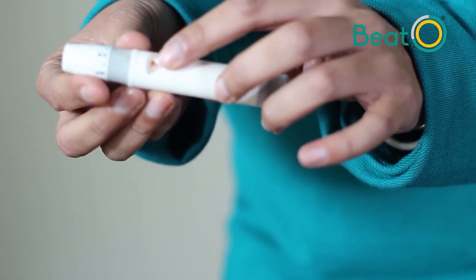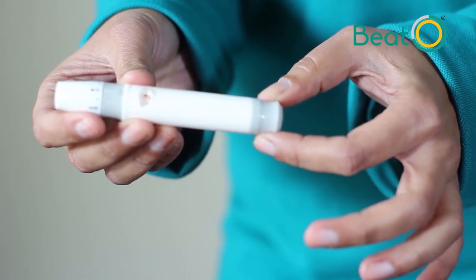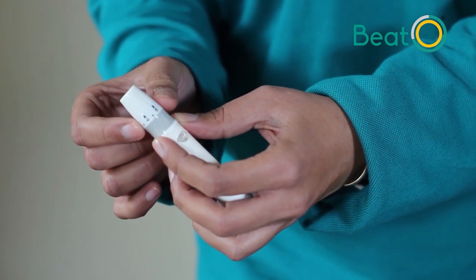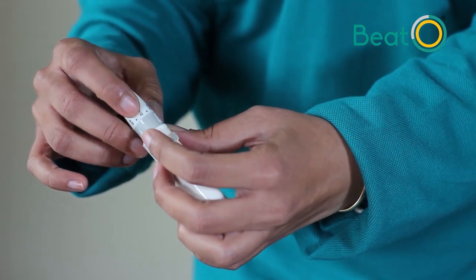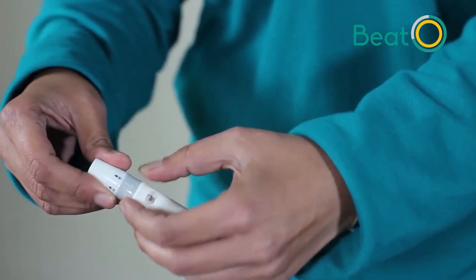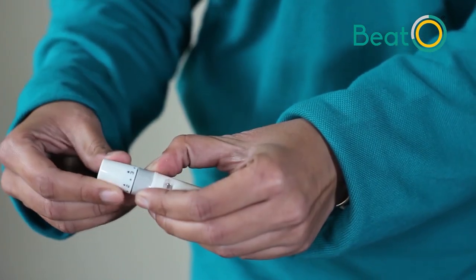Your trigger button should turn red. If it hasn't, pull the sliding barrel to make it turn red. These are the puncture depth settings, which will change depending on your skin type. If you have thick skin, you will need a high puncture setting of 4 or 5. If you have thin or soft skin, you'll need a puncture setting of 3. Hold the gray part and twist it to set the puncture depth.